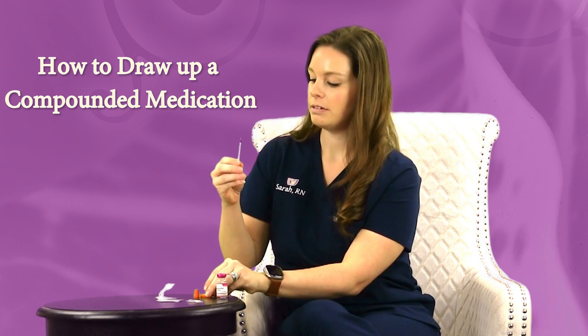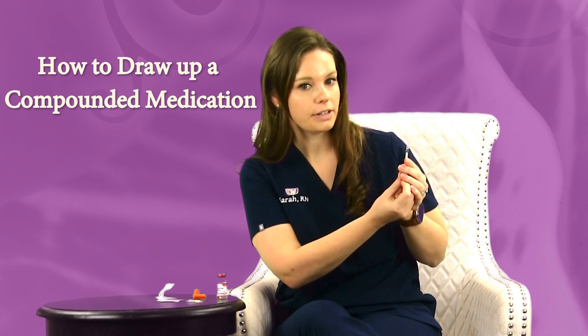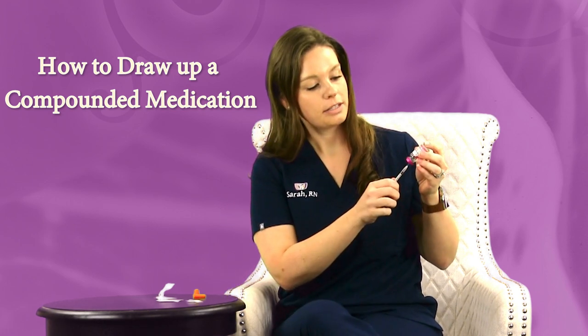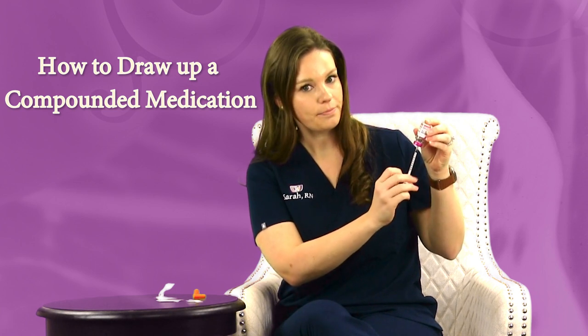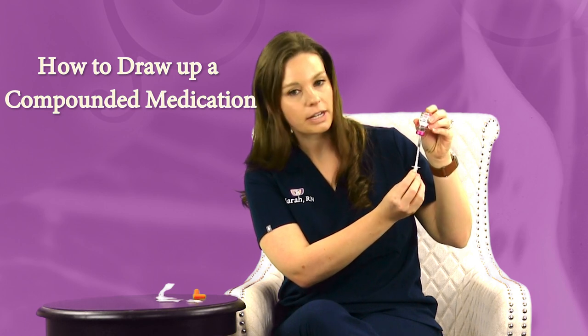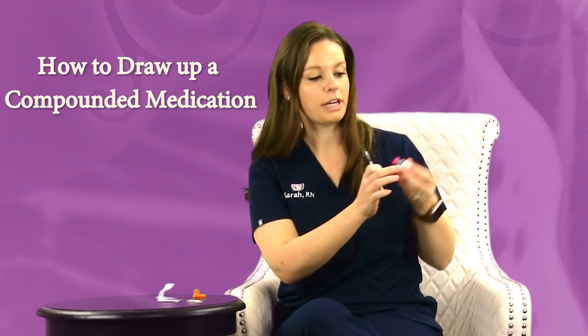For your first round it's ten units. So you're going to draw your syringe up to ten units, and then you're going to inject the air into the vial — it kind of creates a vacuum. Then when you pull down to the ten unit mark again, your medication will follow into the syringe, and you can pull that out.